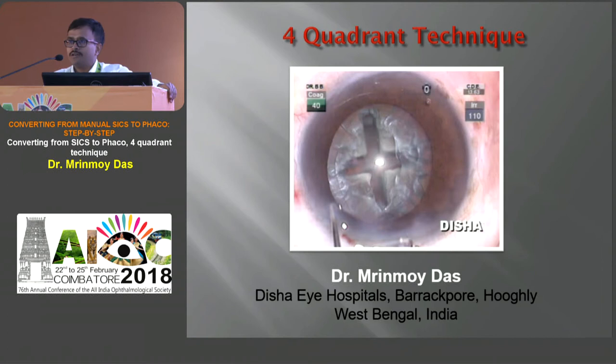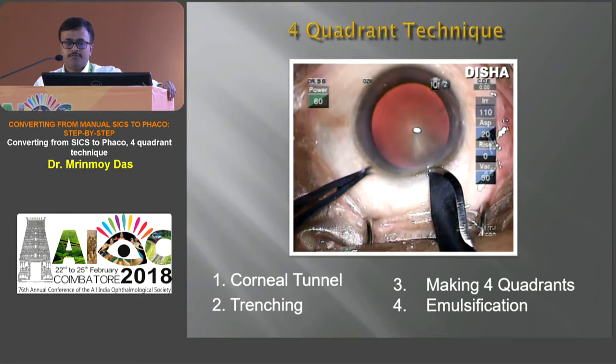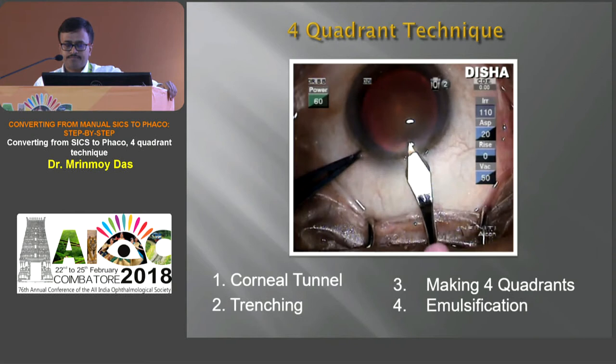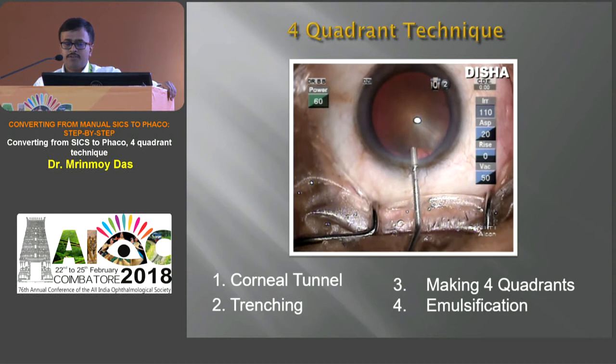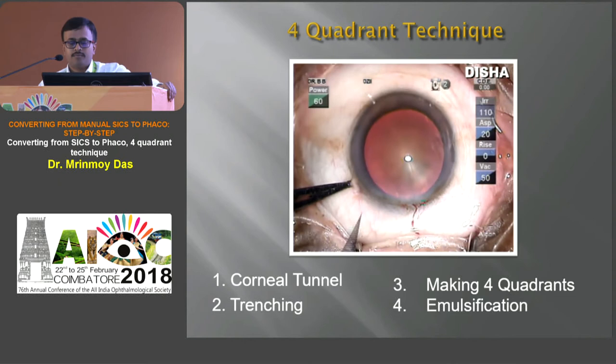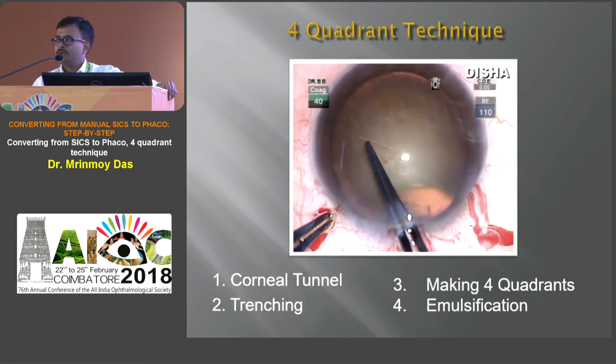Coming to the four-quadrant technique — it is a very simple, classical, and safe technique. Every beginner should learn this technique before going on to stop and chop or direct chopping. This video demonstrates a full case of the four-quadrant technique. First, we are making incisions — a biplanar incision — then putting in viscoelastics to maintain the anterior chamber. Now we are making the side ports, applying all knowledge we have gained from this course. Capsulorrhexis is initiated with the capsulorrhexis forceps — the capsulorrhexis should be around 5 to 6 mm in diameter.